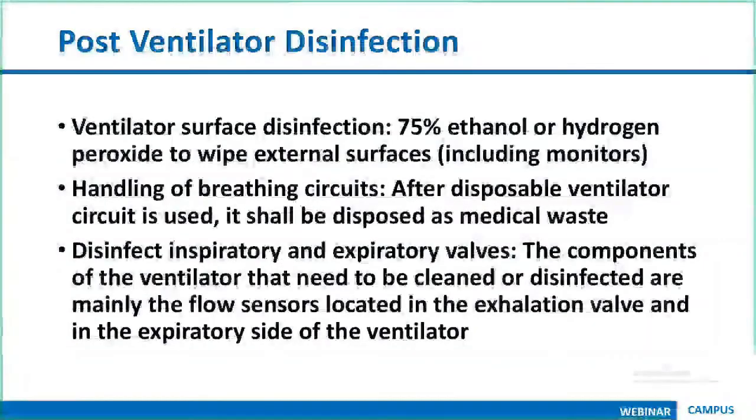On the expiratory part, you have already put a filter at 2 points, so it's unlikely that the machine will get soiled or contaminated. Still, if the ventilator has a removable expiratory side valve, you can remove and clean it. If it is removable, you can clean it with ETO sterilization.